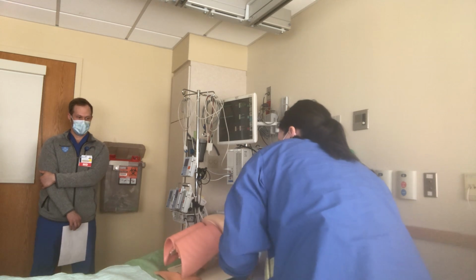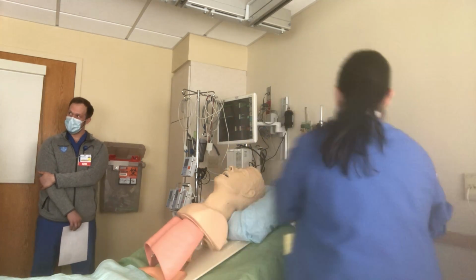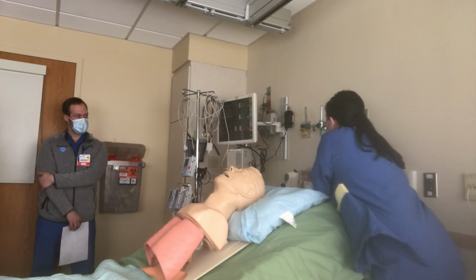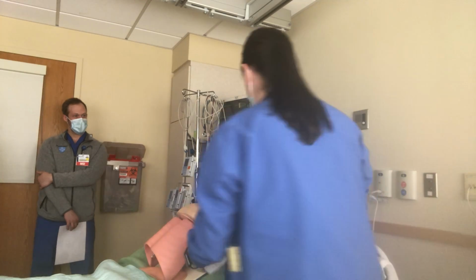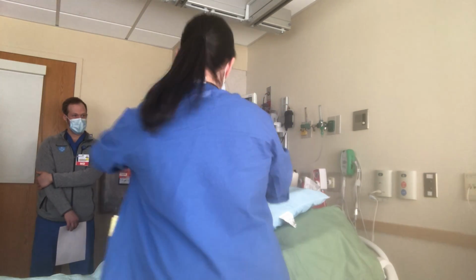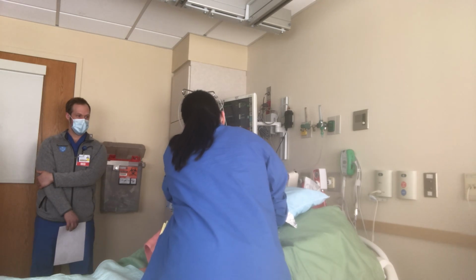The clock is ticking, tick tock, tick tock. Here we go. All right, and then he's still hypoxic. He's still hypoxic. Oh, she's looking for the oxygen. That's good. Thank God there is a nasal cannula in the room. The last one there wasn't. If there wasn't, I would have gone and got one.